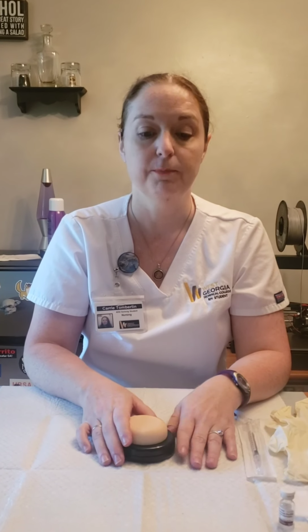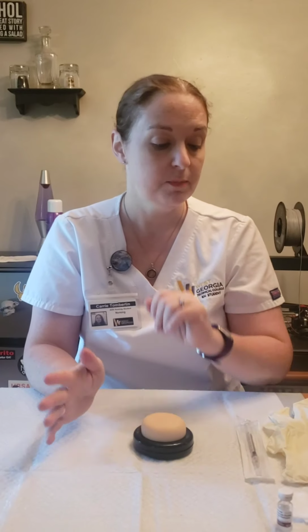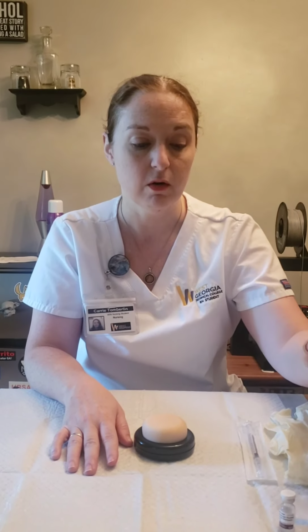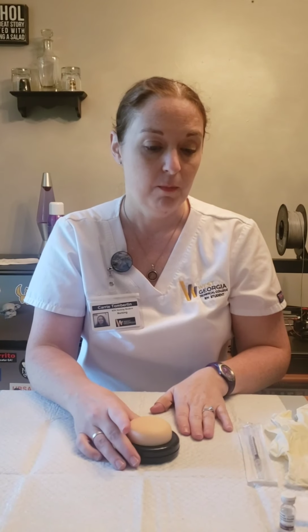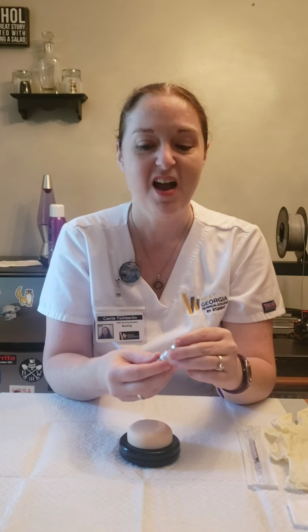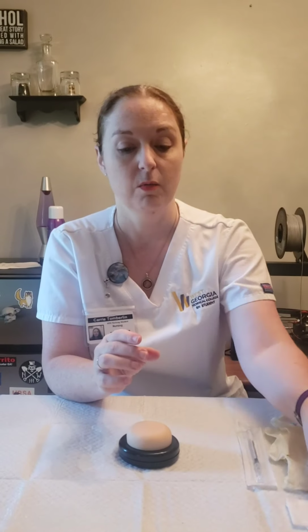So the first thing I would do is check my order from my physician to make sure that I have everything correct. I would select a well-lit area for my patient. I would gather my supplies. I have my gloves, my TB syringe, my 2x2s, alcohol prep pad. I would get my vial from the refrigerator. I would check the expiration date on the vial to make sure that it's not expired. If it were new, I would put today's date on it and my initials, and then I would perform hand hygiene.